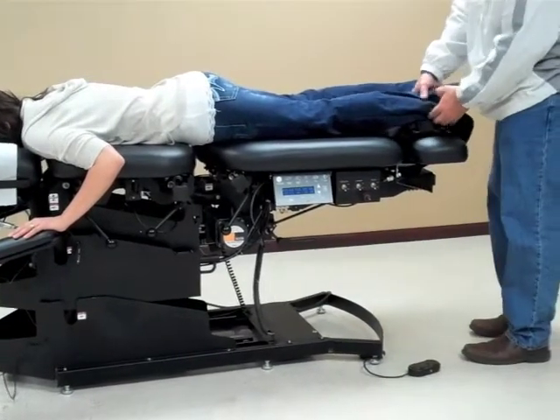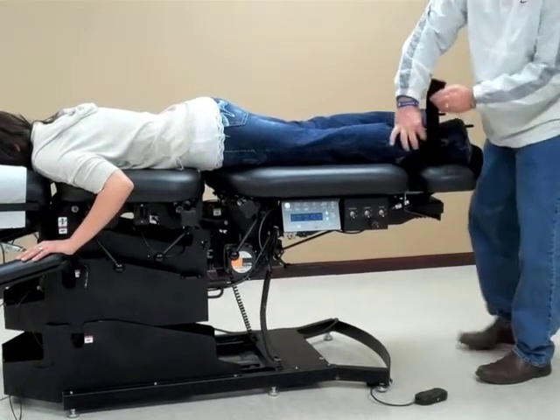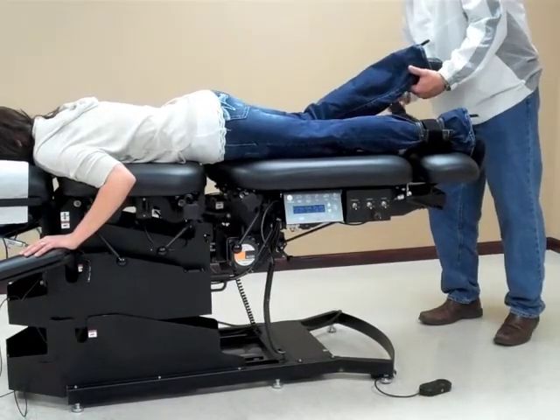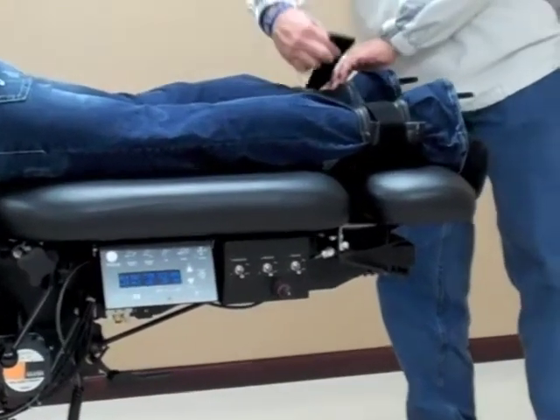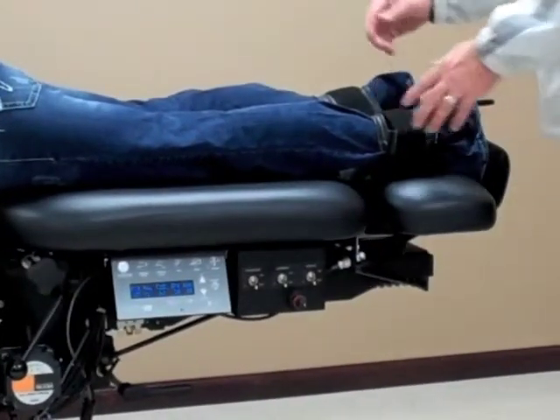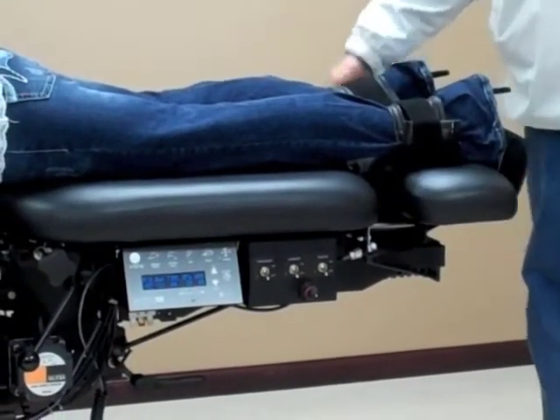Next, you'll use the ankle straps with the velcro, just by undoing and bringing this around. Once we have the ankle straps secured, we can also elongate the table, stretching it just a little bit to make sure the table is tight.